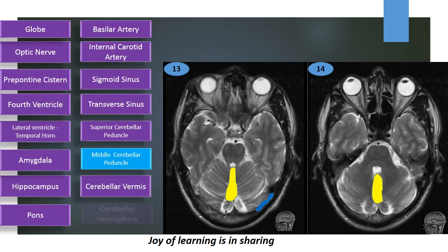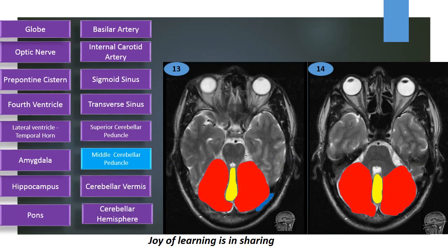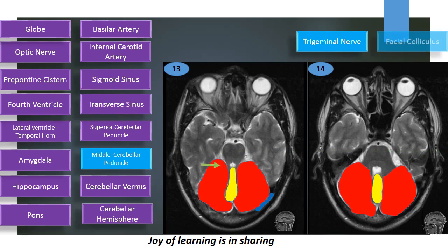Cerebellar vermis, cerebellar hemispheres, trigeminal nerve and facial colliculus in the dorsal median pons.